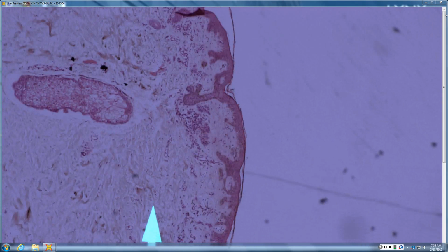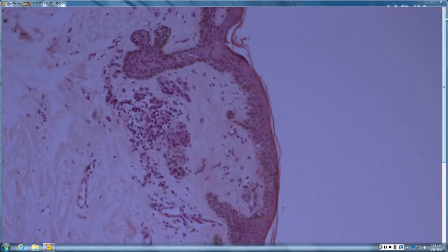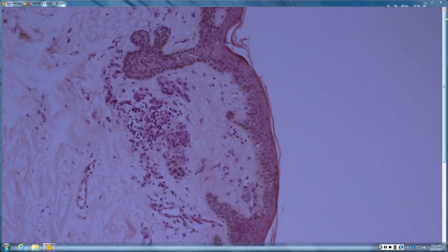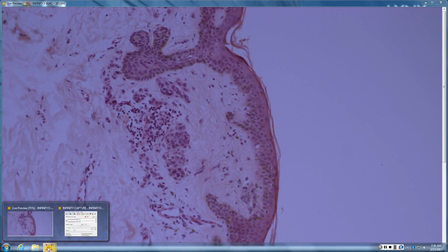So there appears to be something in the superficial dermis next to that follicle. I'm not sure. Yeah. So you got some little round nests here. There is also some nesting, the degeneration. There may be a little bit of scar, so I'm thinking at this point recurrent residual nevus.